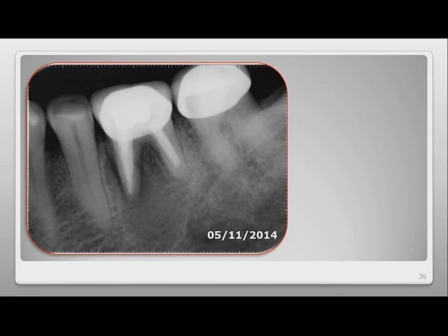And, even when we cut the X-ray, in the clinical image we can observe how this instrument, which raises the periosteum, penetrates into the lesion almost 10 millimeters. So, this allows us to assess the severity of the lesion.